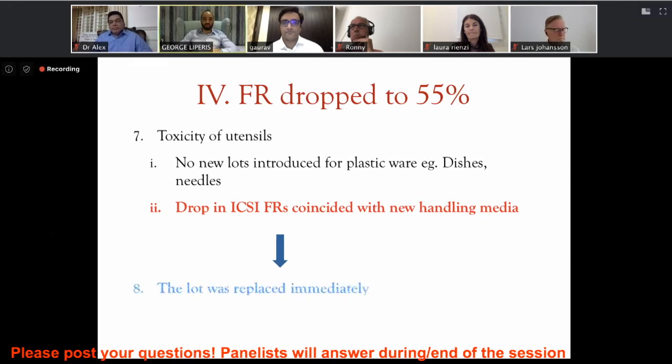Toxicity of utensils is very important too. Any new lot introduced for plastic and media needs to be tested, either by using sperm survival methods, or if we have access to unfertilized oocytes or abnormally fertilized embryos, we can use those to test toxicity for the media and the plastics.